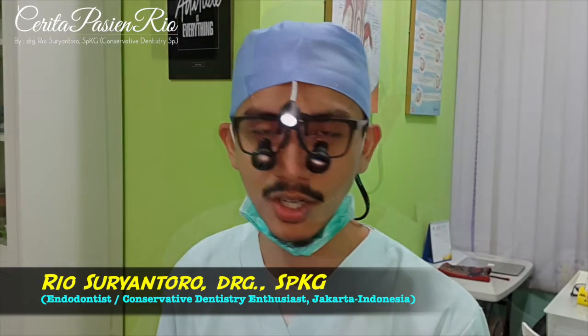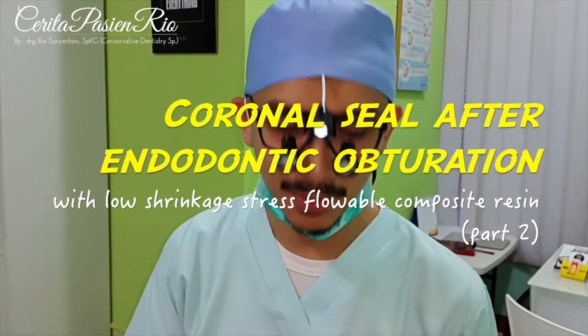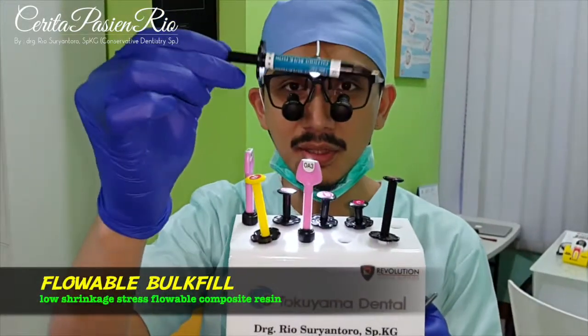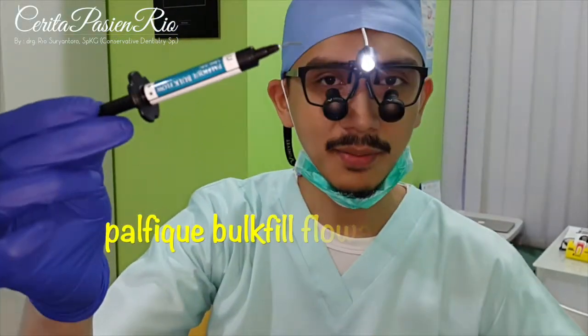Today we are still doing endodontic treatment. I've already finished my operation. Like usual, today we are going to do a coronal seal. But today I will do this coronal seal with this — a low shrinkage stress flowable composite from Tokuyama. And this is what we call the Palfique Bulk Flow.